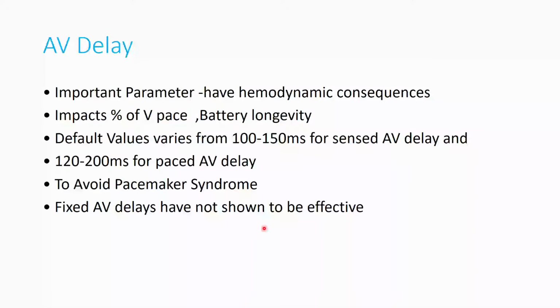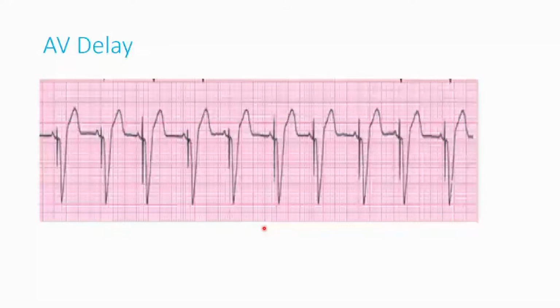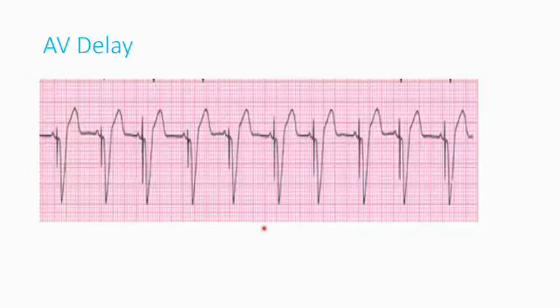But you have to maintain appropriate AV synchrony. So here let me give you one example. Suppose there is a pacemaker patient's ECG, a dual chamber pacemaker, with activity in the atria and ventricle. Just assume what is happening in the atria. Is it pacing in the atrium? No. Is it pacing in the ventricle? Yes. Is it tracking what is happening in the atrium? Yes. So what mode is it? ASVP. Yes, Anand, good. So ASVP is happening, sensing in the atria and ventricular pacing.